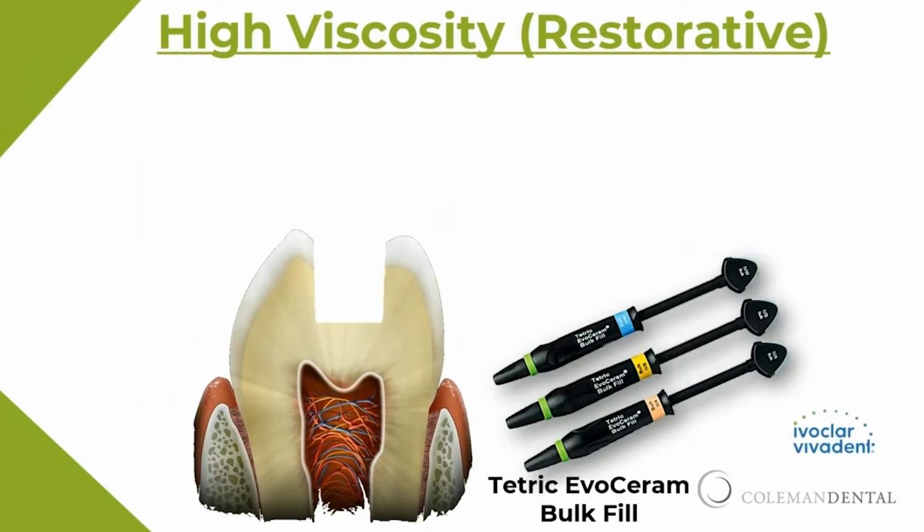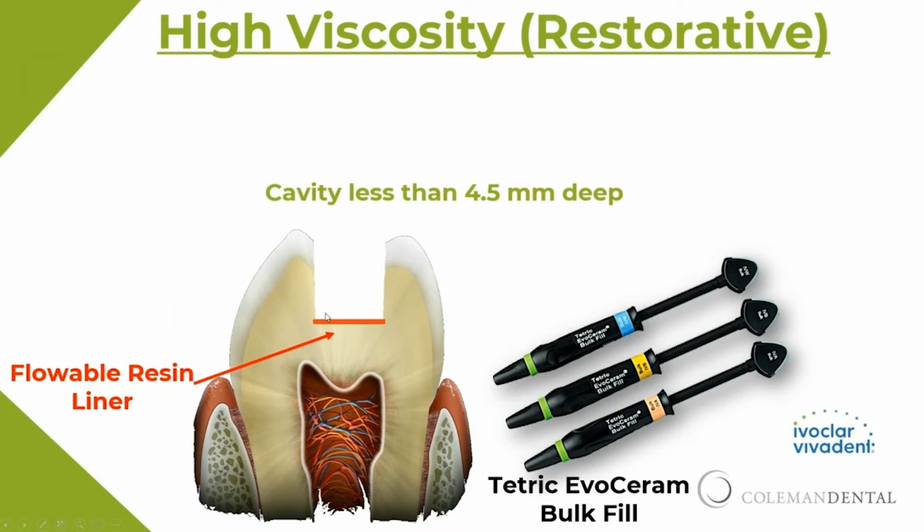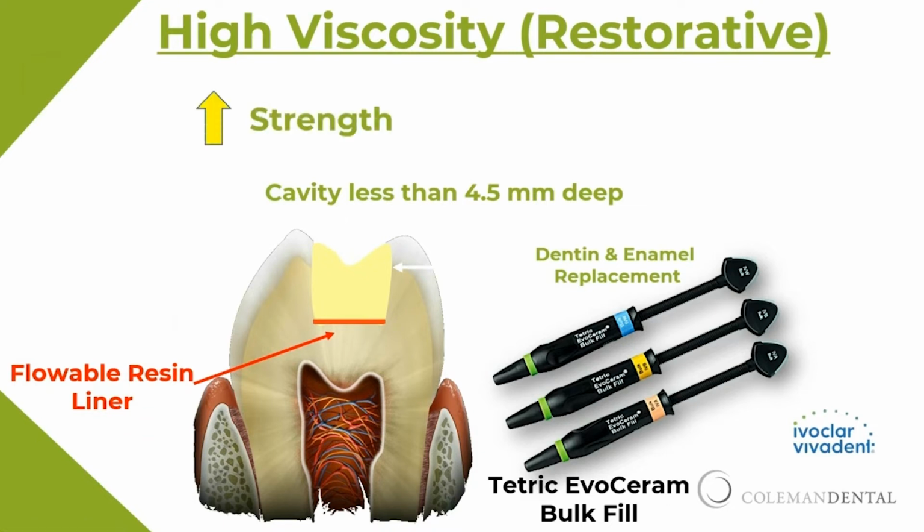So some of the bulk fill high viscosity restorative materials. Again, Tetric's a good one. You're going to put a little bit of liner because it doesn't flow around and you're going to want your adaptation really well. And then you're going to just fill the rest of it up. You're going to need no deeper than, say, 4.5 millimeters because of curing depths of those. And again, you put your flowable in, cure that, and then come back and put your bulk fill on top of it. The increased strength is great because you're getting a true restorative for the majority of it. But adaptation's low because you have to have a liner, and the liner's not going to go everywhere.